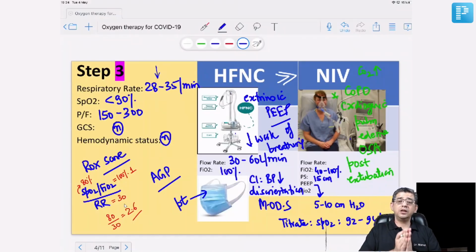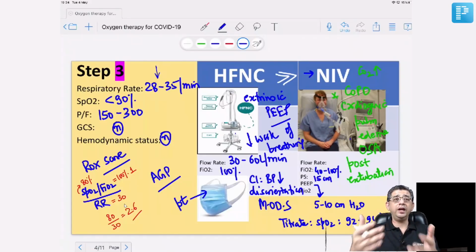Non-invasive ventilation is definitely not recommended in patients who cannot maintain their sensorium. If there is a high risk of aspiration, if a person is having low GCS, then this technique can definitely not be used. In fact, there's a separate lecture in the app where I have specially spoken regarding invasive mechanical ventilation in comparison with non-invasive ventilation. You can go through that, and that would definitely help you in broadening your horizon.